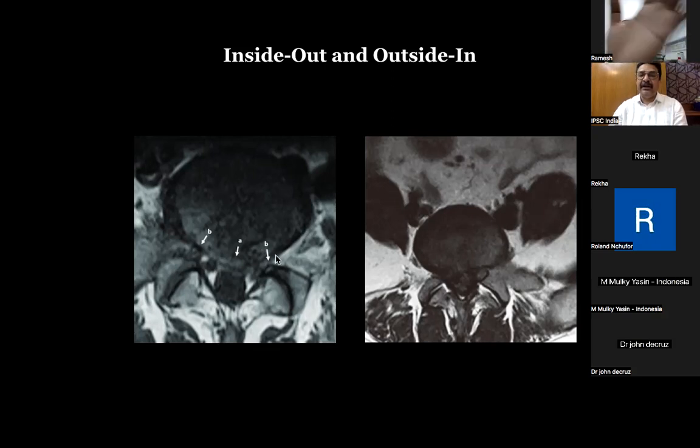You may not be directly hitting the nerve, but whatever you are putting inside is going to take some space, right? If the canal or the nerve root is already compromised, and you are putting a working channel inside, that will further compress the nerve. You may be doing your job over here, and this nerve is compressed for a longer time, and you may have some loss of sensation at the end of the procedure.